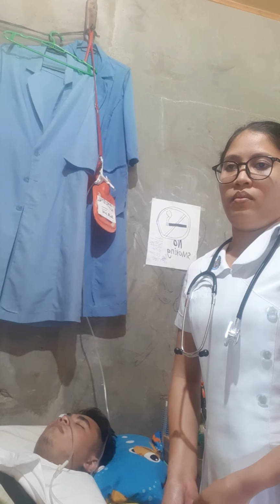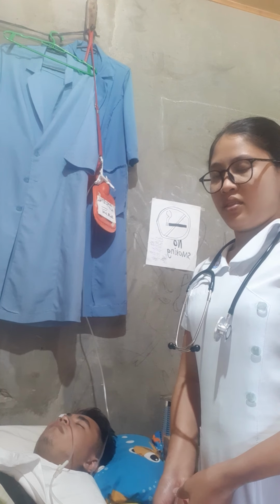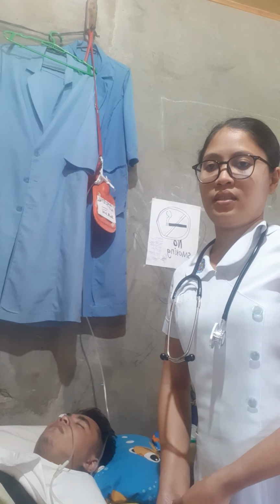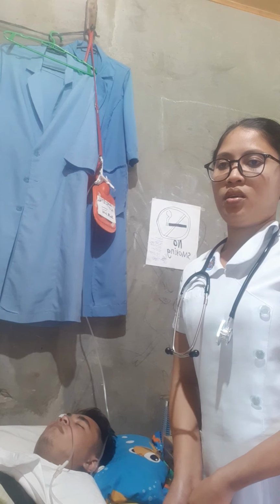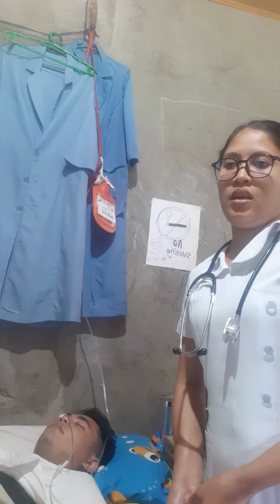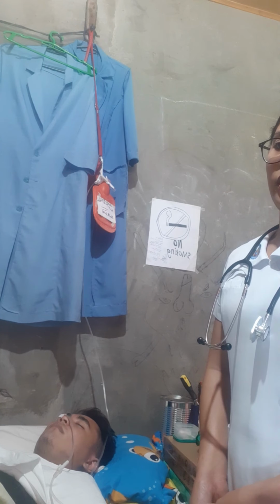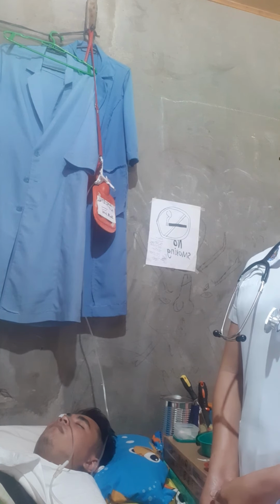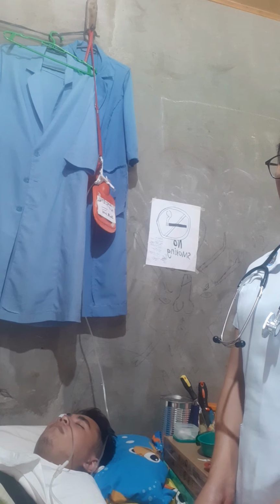Then check the agency or institution's policy on the frequency of changing the nasogastric tube and the use of a smaller lumen tube if a large bore tube is in place, because these measures prevent irritation and erosion of the pharyngeal and esophageal mucous membranes.